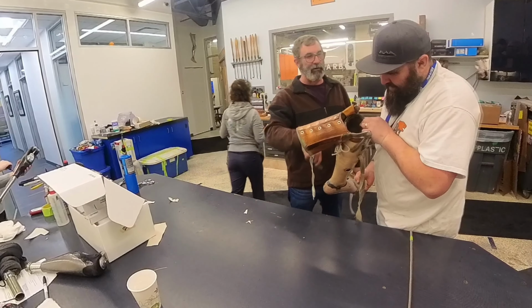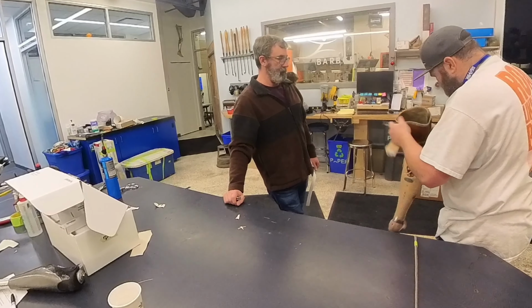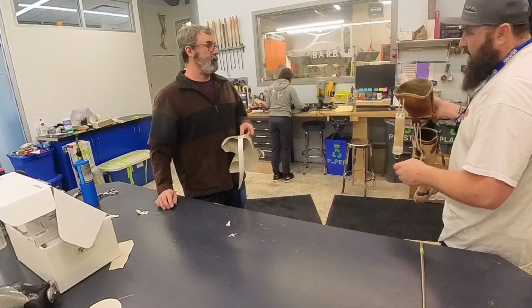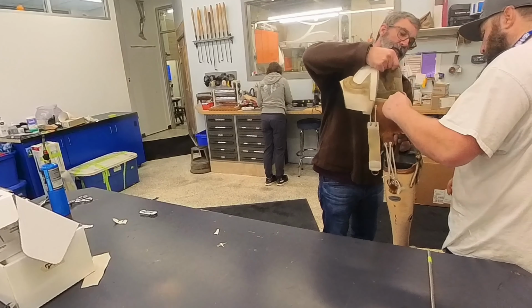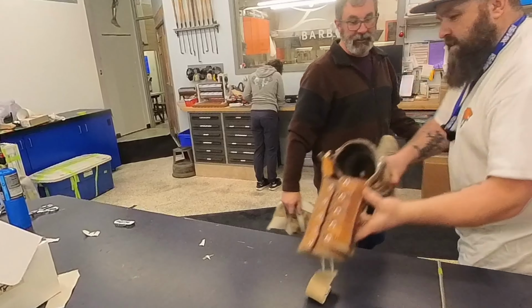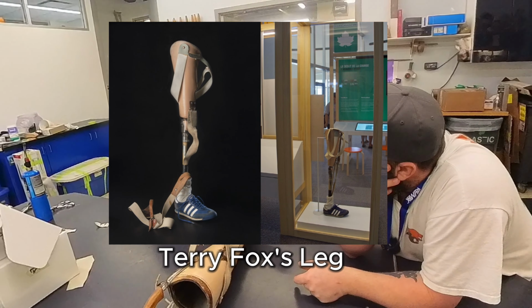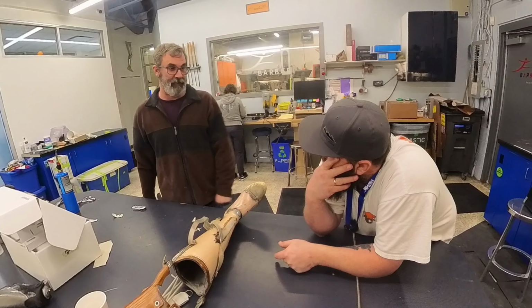So there's nothing to them, right? They're thin. But what returns it then? Oh, okay. So this is going to come up. Oh, this is the elastic band. Yeah. So then it flexes, and we call it an extension. So this is after like Terry's leg, because Terry had one down the middle, right? Oh shit! This is 1953, dude. Terry Fox isn't even born yet.